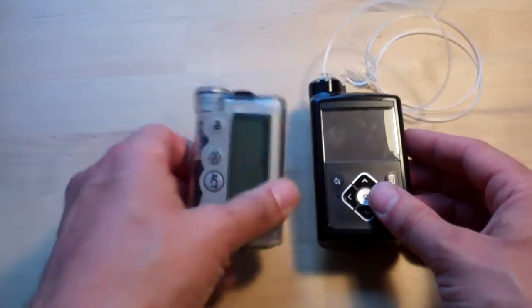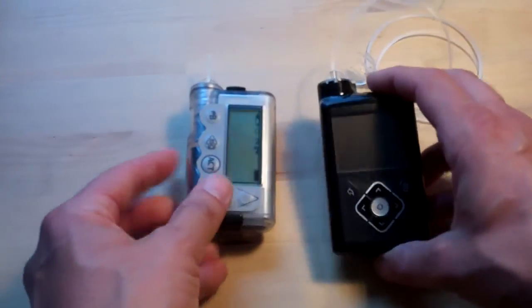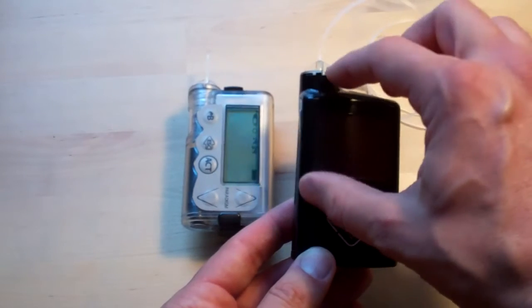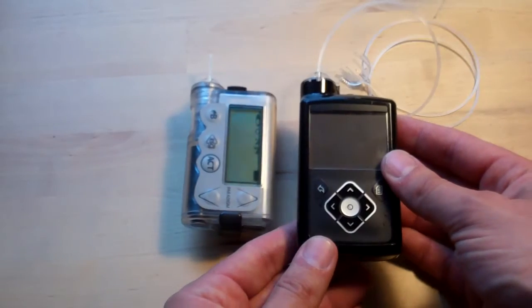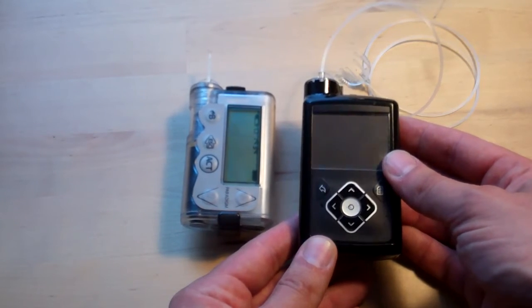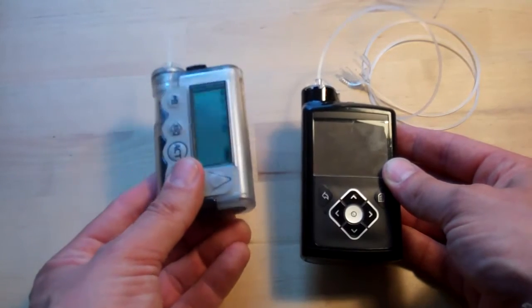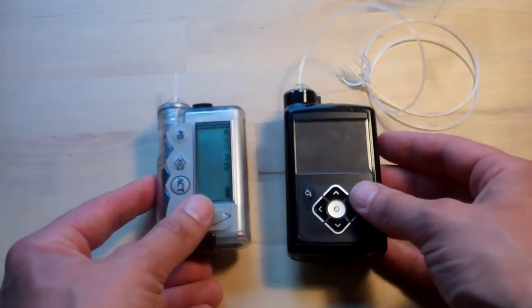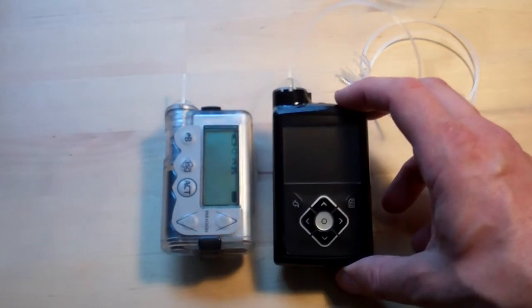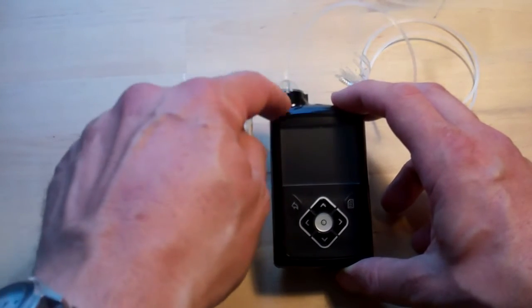This is a 5 series Veo — the one that only takes the smaller cartridge size. On the 640G there's this sticky-outy bit to take the longer cartridge, the longer reservoir, which takes 300 units. Whereas the Veo only takes 180 or thereabouts. The smaller 640s will be exactly the same size for the rest of it, but they just won't have that little extended bit.